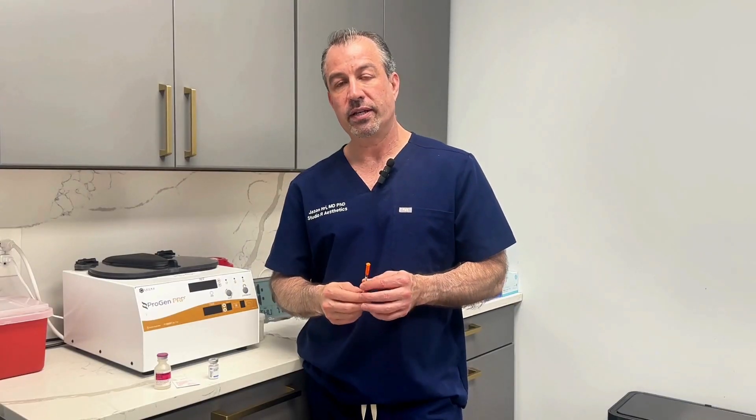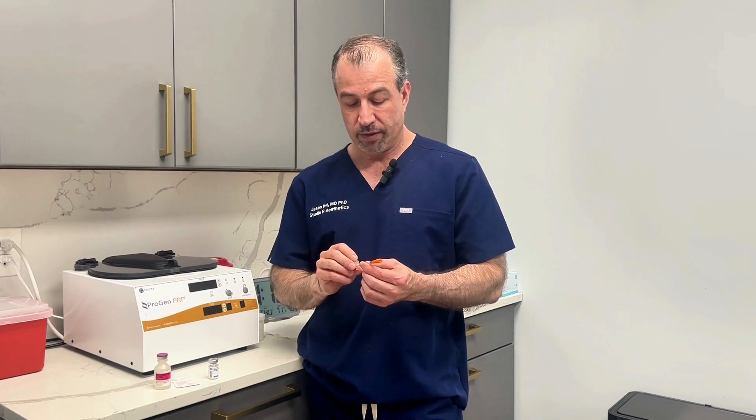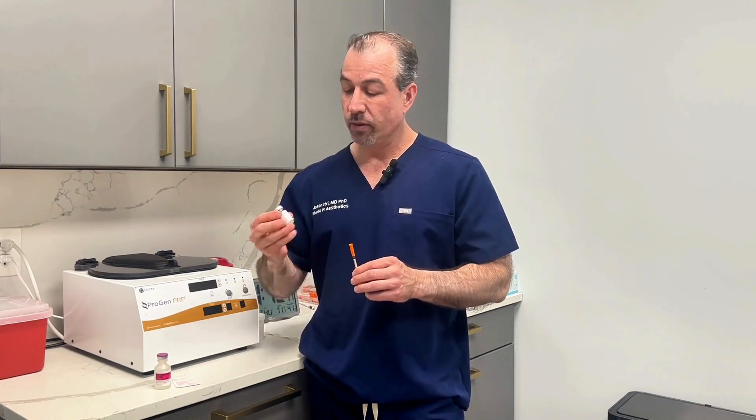Hey, I'm Dr. Jason Itri at Studio R Aesthetics, and I want to show you how to do a shot of semaglutide. This is one of our syringes. Here's the semaglutide.